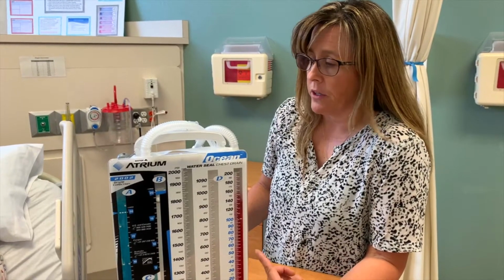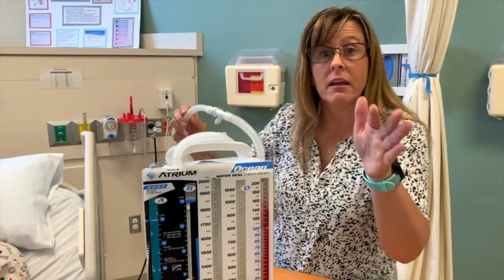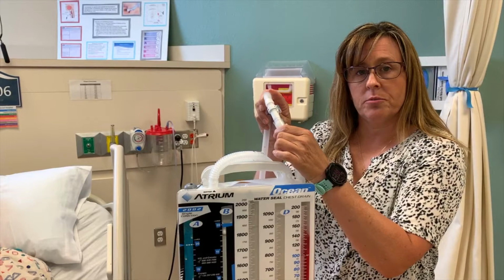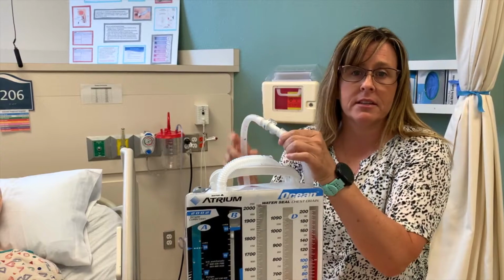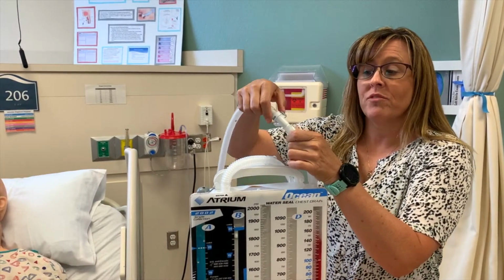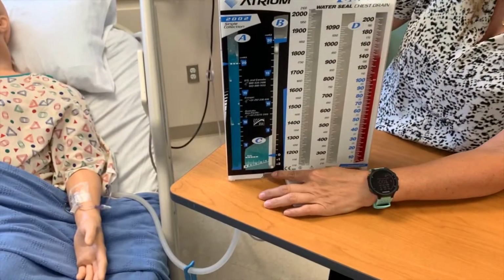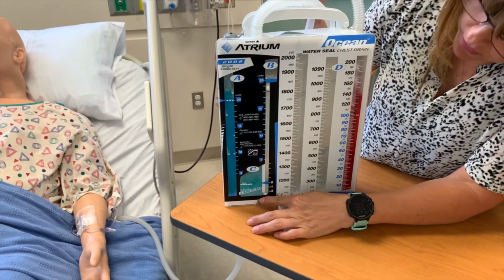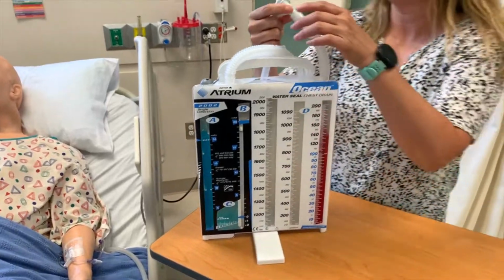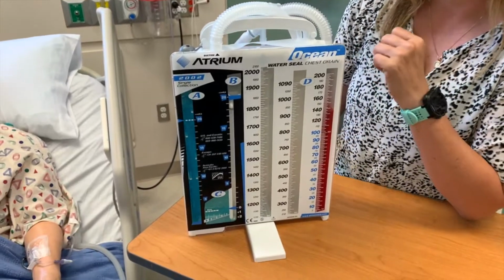All right, guys, so now air leak. We're going to do air leak from the actual chamber itself. Sometimes, it really doesn't happen, but it may, you never know, that this connecting tubing, so you know how we talked about tape, make sure your tape and your connections are always connected. Maybe this connection got disrupted. So when this gets pushed and pulled out, look what happens down here, guys. You have that noted air leak that's occurring. That's not good. There's some type of air escaping into your patient. So make sure you check these connections and you get that back and sealed once again.